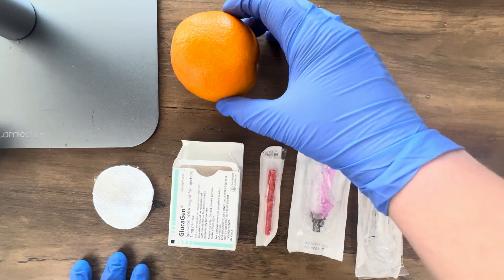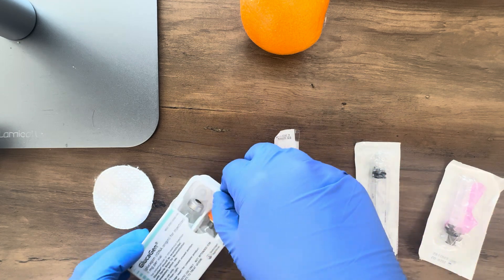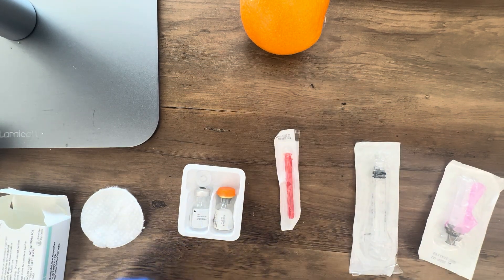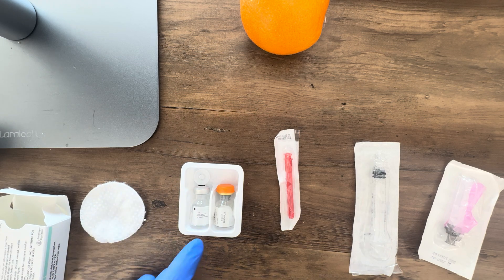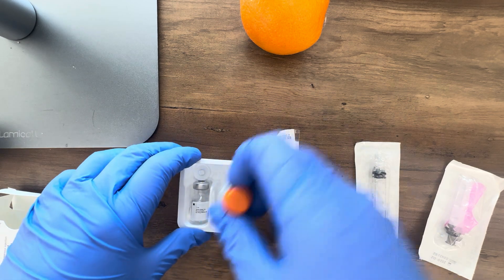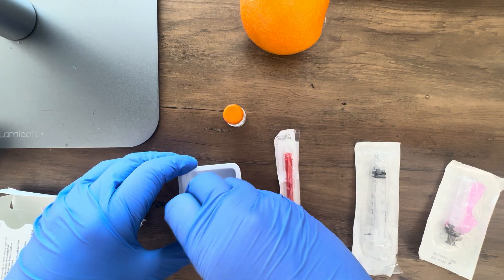When you open up your medication, you'll see that you have two vials. The cap is removed on this demonstration one. You'll have a vial of sterile water and then a vial that has a powdered disc in it. Glucagon solidifies if it's reconstituted for a long time, so it's something we need to reconstitute right before we administer it. The first vial we'll be using is the one with the white cap, which is your sterile water vial.